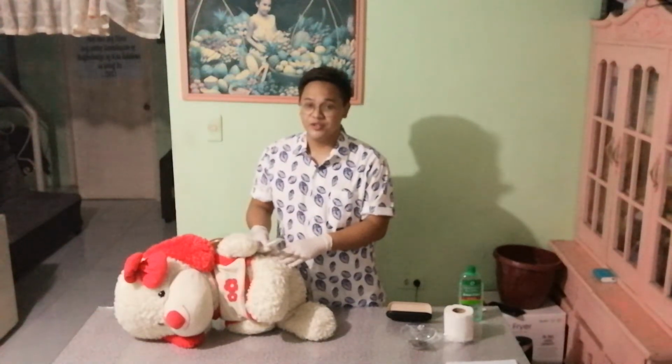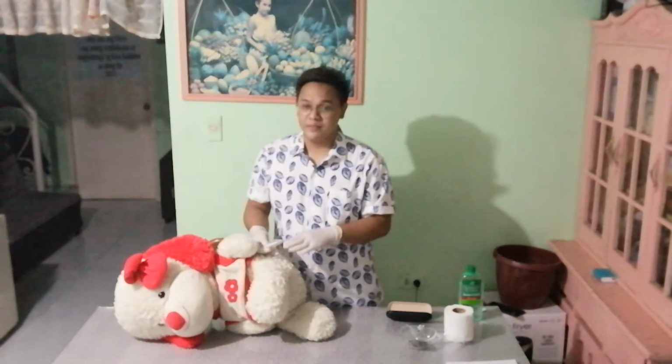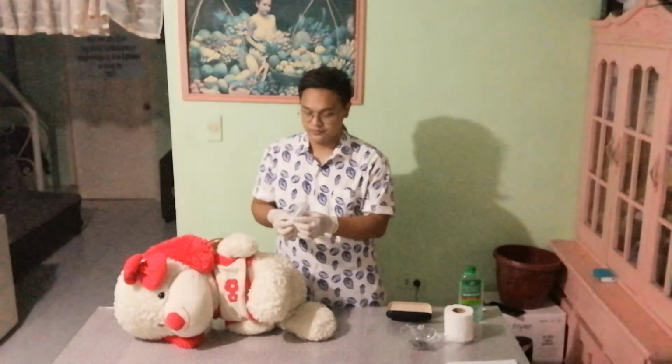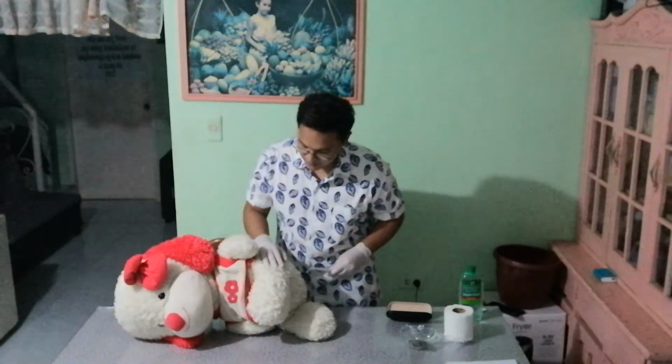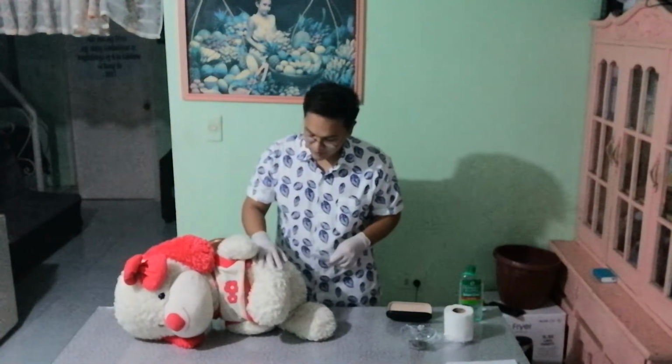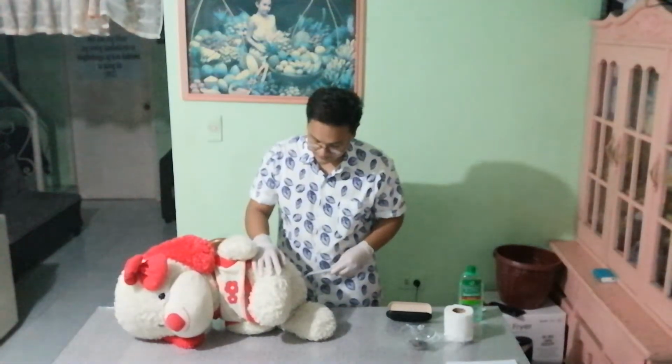Our sixth step is we need to insert the thermometer in the anus for about 1.5 inch in an adult and 1 inch for children. Ma'am, I am about to insert it now, the thermometer. You may feel a little bit of discomfort, so please relax.